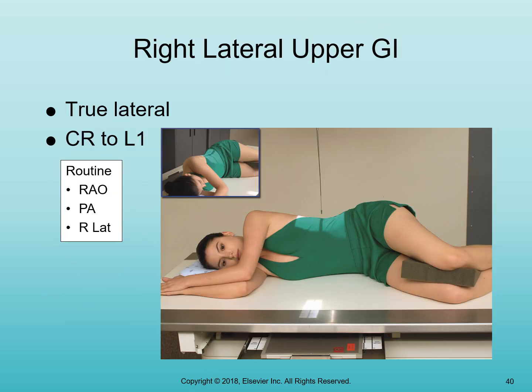Our last image is a right lateral. I know on the esophagogram we said that it could be either lateral, but for the upper GI it is definitely the right lateral that is done. Okay, so patient lies on their right side.